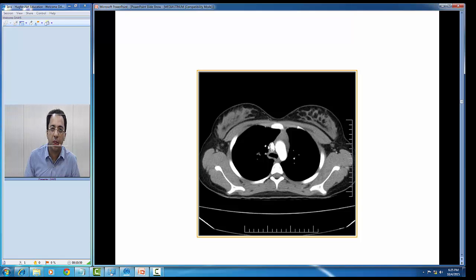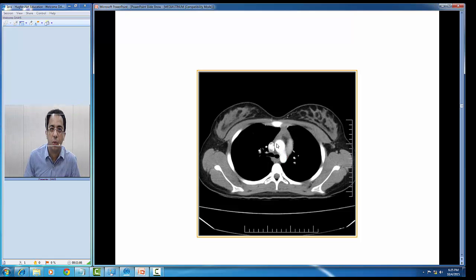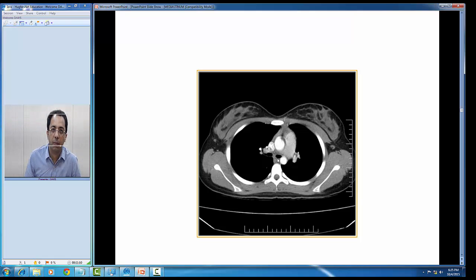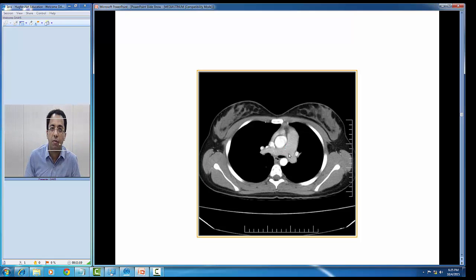Going down, you can now appreciate the superior vena cava. You can see the triangular-shaped thymus shadow and the arch of aorta dividing into the ascending part and the descending part. The trachea is bifurcated into two. You can appreciate the superior vena cava, ascending aorta, and pulmonary trunk dividing into the left branch and the right branch.